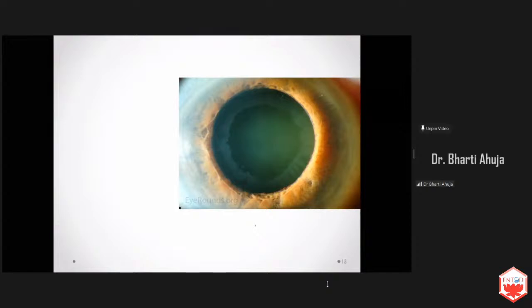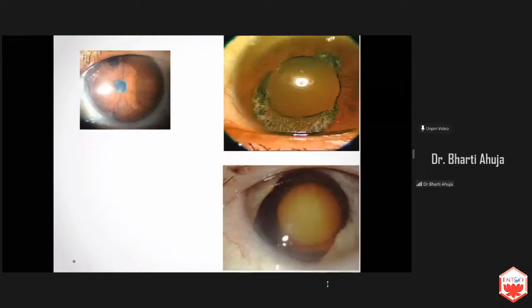Glaucoma associated with pseudoexfoliation has issues with weak zonules, so a CTR ring needs to be arranged prior to surgery. Fragile anterior capsules: surgery needs to be done under a good high molecular weight viscoelastic so that the rhexis should not escape. Again, staining of the anterior capsule is important. Poor mydriatic eyes, so pupillary dilatation again is a concern.